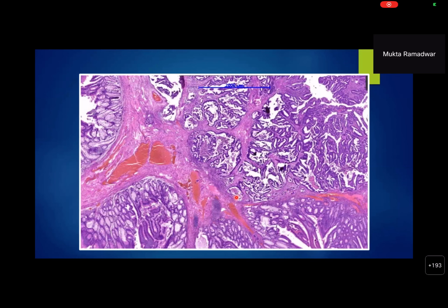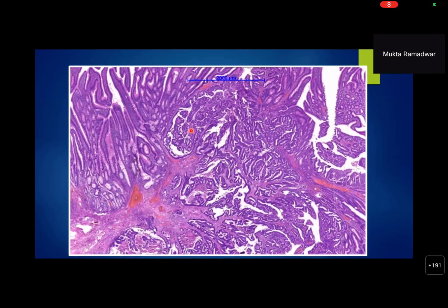Very, very distorted. Today I haven't included any pseudo invasion, but when there is pseudo invasion, the glands would carry the lamina propria with them, and they would show retained lobular architecture. Those are the keys. Here, there is a complete disorganized way of invading the submucosa through muscularis mucosa. So this is not it. See these glands, literally single glands are breaking off these disorganized architectures.